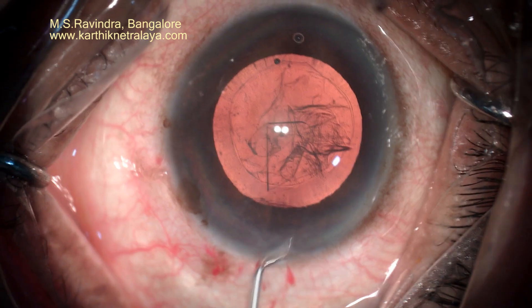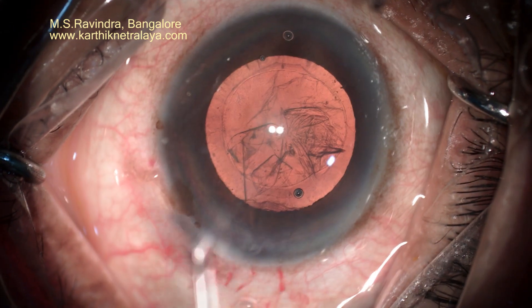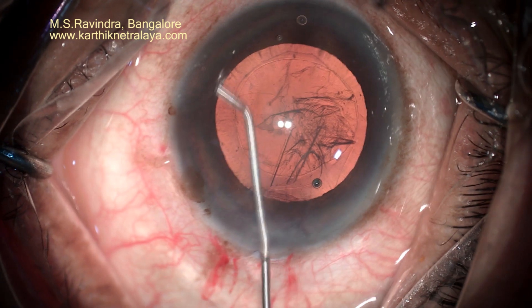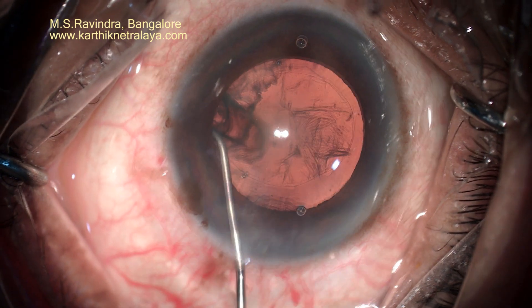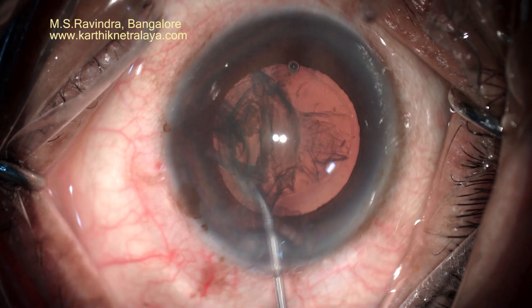The tunnel is enlarged with a blunt keratome. 1% lignocaine is applied on the surface of the iris, and the same can be used to perform hydrodissection.